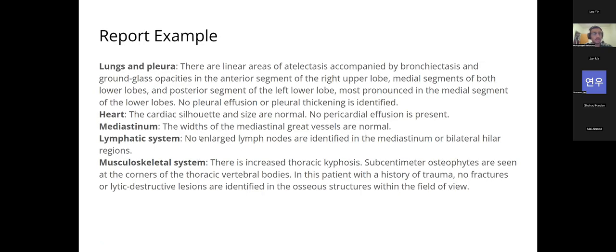So this is a quick example of what the report looks like. You can see it's split into different regions. And then we evaluate each region in isolation.